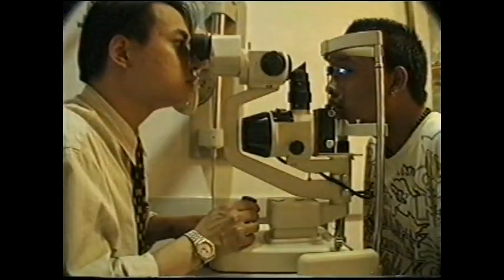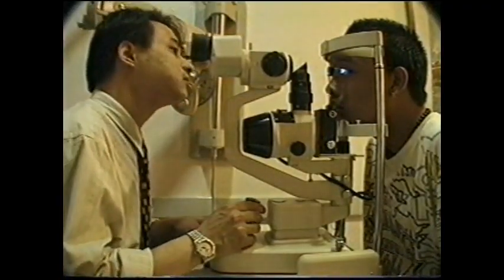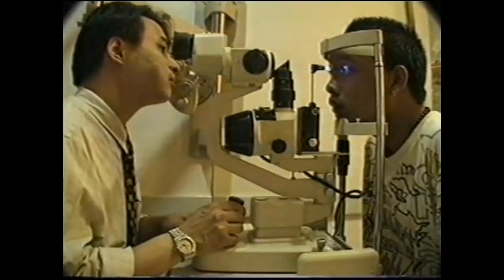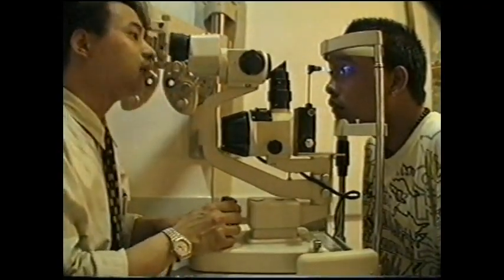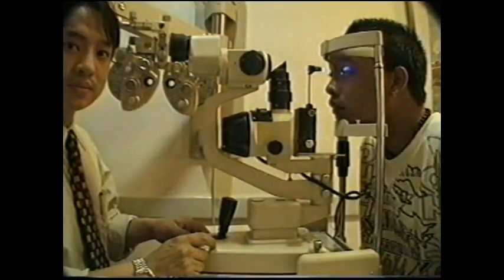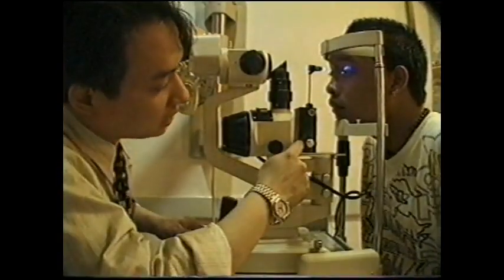With the slit lamp control handle, pull the tonometer biprism away from the patient's eye. Note the reading on the numbered dial and multiply the number by 10 to obtain the intraocular pressure in millimeters of mercury, and record the pressure in the patient's chart. Repeat the procedure for the left eye.